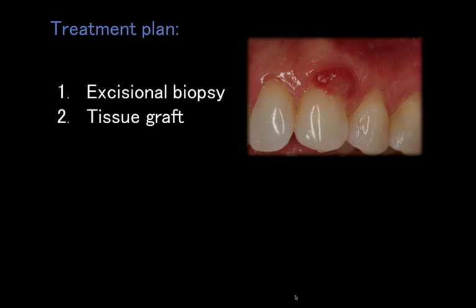Now, the timing of it can vary. We can do it at the time of biopsy, which is the approach I took, or we can wait for everything to heal and perform the graft later on. I felt there was an advantage to do it at the same time because it was a surgical opportunity. The patient was already anesthetized. The area was already deficient and receptive for a new graft.